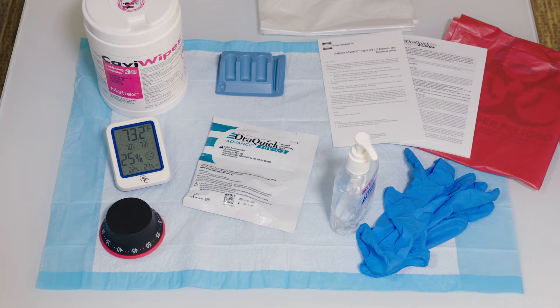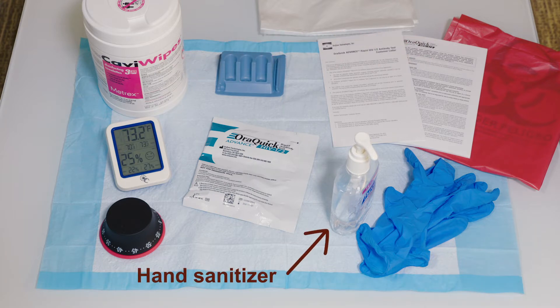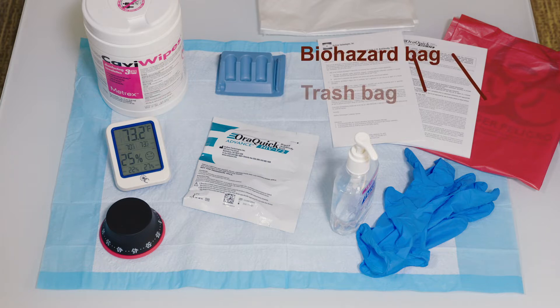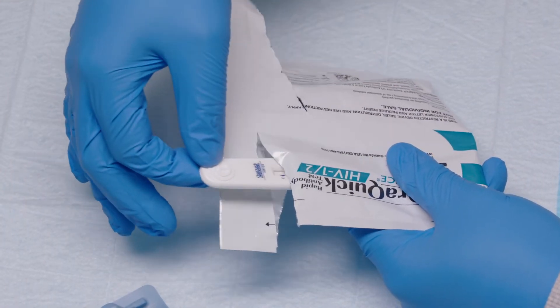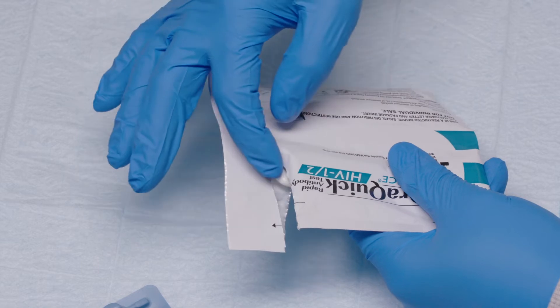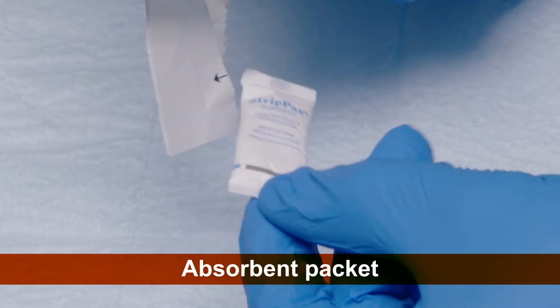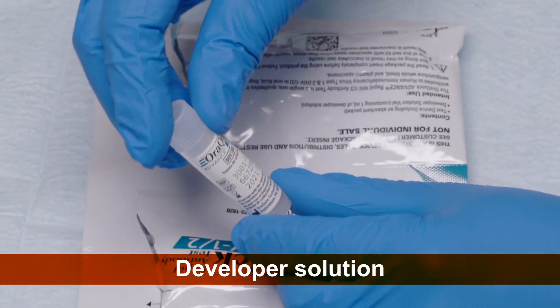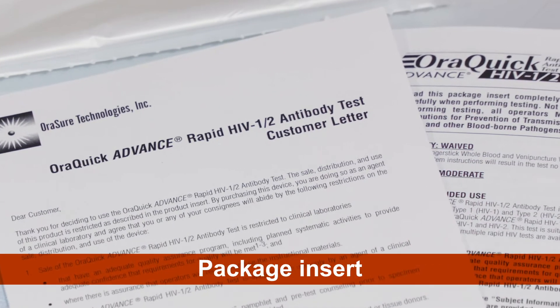Begin by setting up your workspace with the items not included in the test kit. If using the OraQuick Advance Test, you will also need an absorbent pad, a timer, a thermometer, disposable gloves, disinfectant wipes or 10% bleach solution, hand sanitizer, a biohazard bag, and a trash bag. Once you have gathered these materials, open both sides of the divided test kit package. Leave the test device inside its corresponding pouch for now, but remove the materials from the other side of the test kit and lay them out on your workspace. The kit will come with a test device, absorbent packet, developer solution, a reusable test stand, a customer letter, and a package insert.